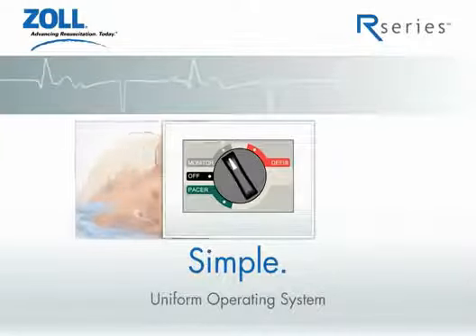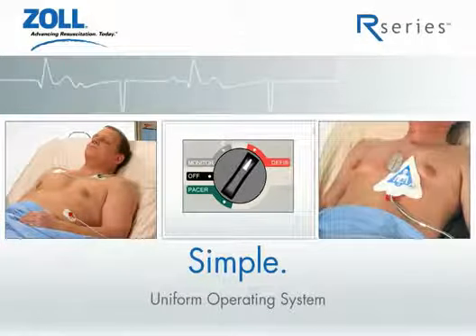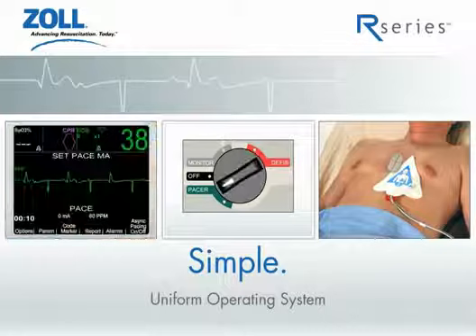The gray zone is for monitoring your patient. The red zone is for defibrillation. The green is for pacing.